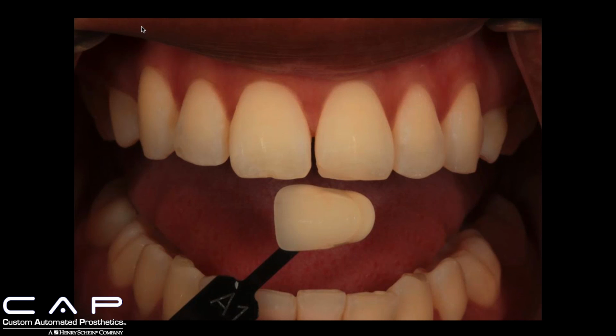or the shade guide comes too far forward, and depending on your point of focus, which should be the tooth, but with everything moving around, if that shade tab isn't almost perfectly in line with the natural tooth, it's going to be either out of focus just slightly, or your values are going to change and your exposure is going to change because it's either closer to the flash or farther away from the flash.